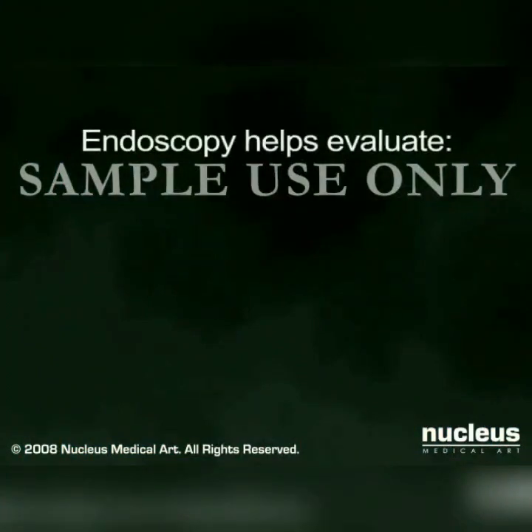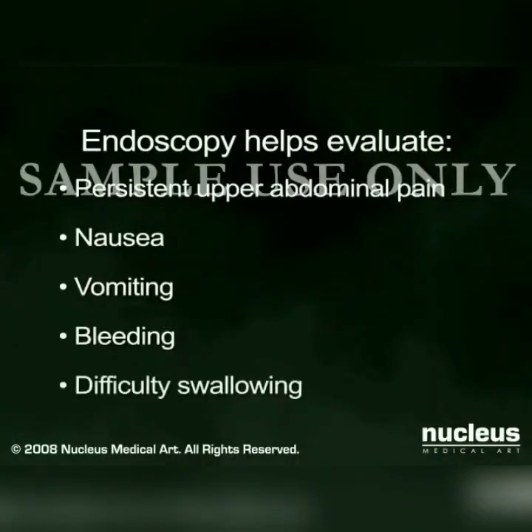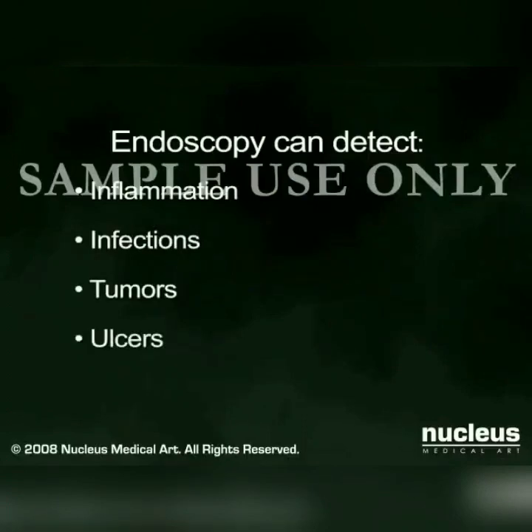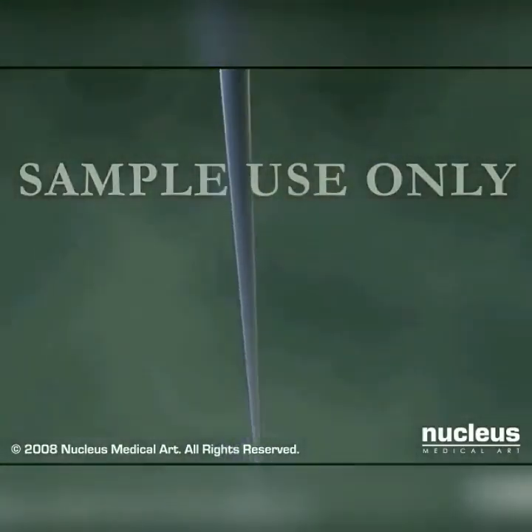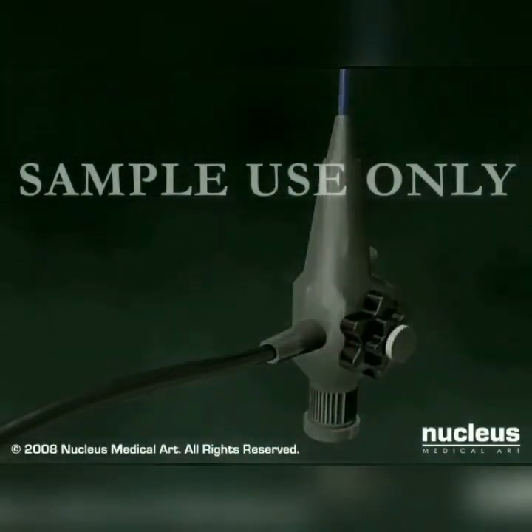Upper endoscopy is used to evaluate symptoms of persistent upper abdominal pain, nausea, vomiting, bleeding, or difficulty swallowing. It can accurately detect inflammation, infections, tumors, ulcers, and other problems that may be present. The procedure is performed using an endoscope, which is a long, thin, flexible tube with a light and a tiny video camera attached to the end. The camera transmits an image to a monitor.